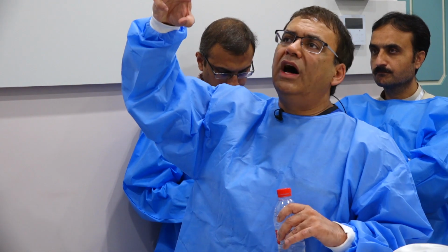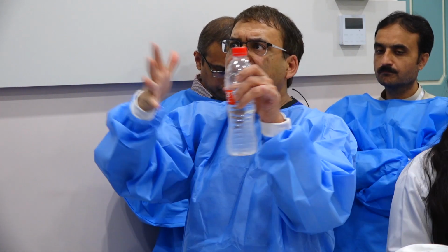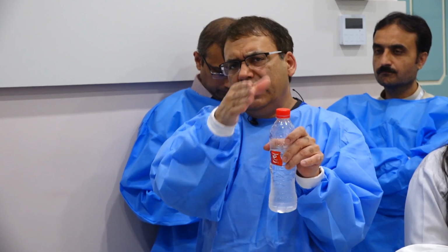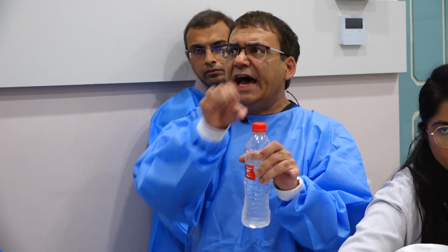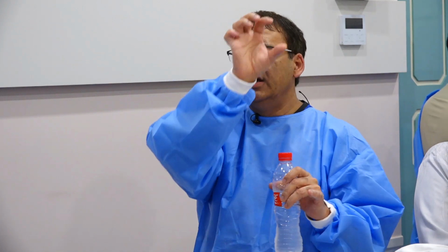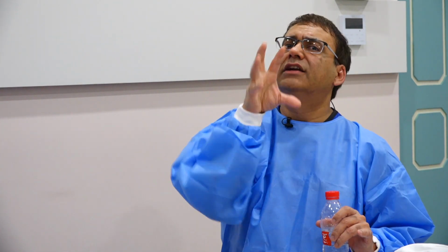When the walls come really collapsed onto the stent, like they are hugging the stent, whenever you move, even moving the transducer around, you don't see the gap between the stent and the wall. That is the area, and right above the stricture, the wall separates and you can see a dilated bile duct. And it's going to be a thickened wall there, wherever it is hugging the stent tightly.